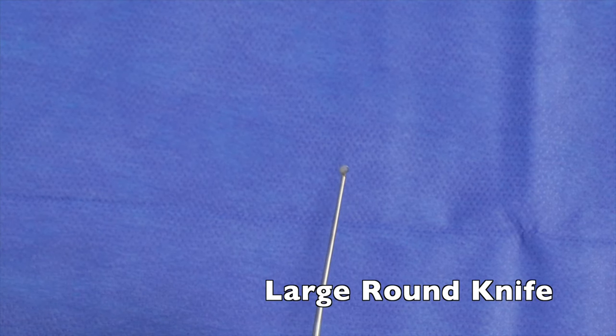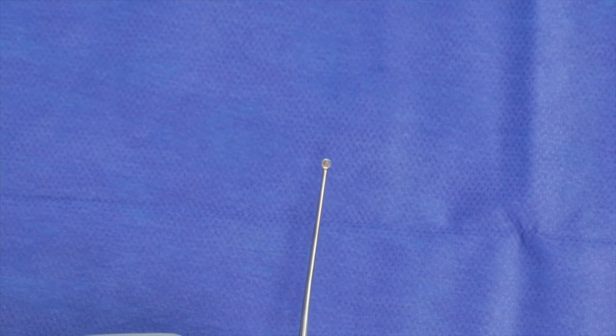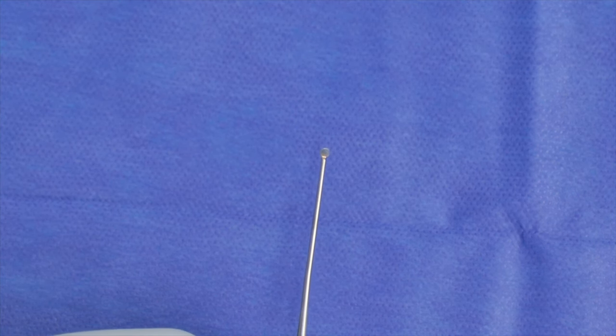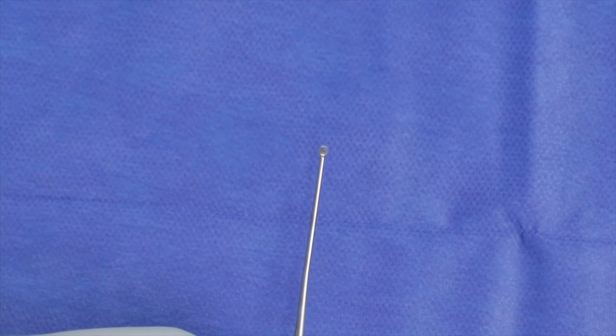Here we have a large round knife, similar to the sickle knife except it doesn't have the point. There's also a small round knife. This is most commonly used when you're making your canal incision — your horizontal canal incision — and raising your tympanomeatal flap towards your annulus. You're able to elevate and suction behind the leading edge of the round knife.